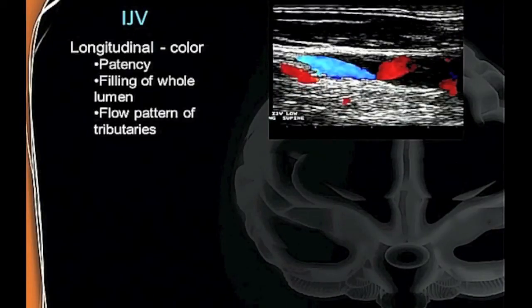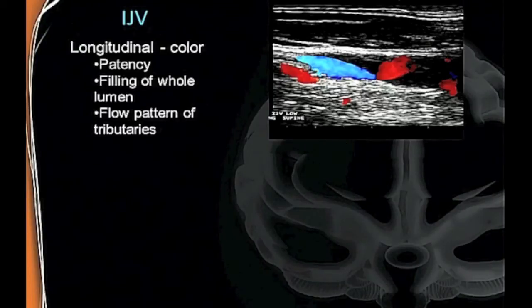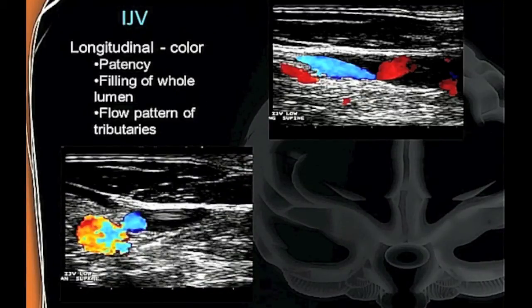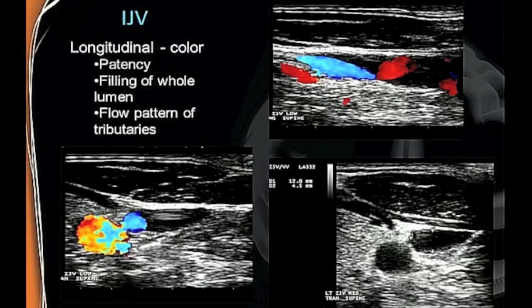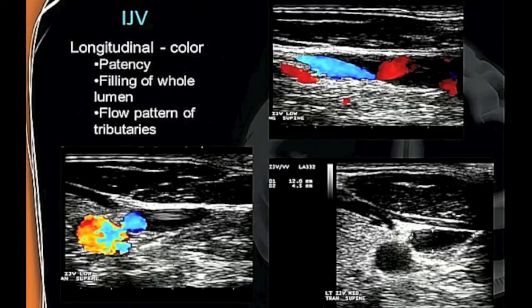Here's why we measure the color flow and not just the lumen. In this example of longitudinal color flow, you can see that something's not filling with color. In transverse, you get the same effect—a black area. If you were to measure just the lumen, you'd measure it much larger, when actually that black area is not flowing. This patient went on to IVUS, and there was a septum there stopping the flow—IVUS showed it at the exact location. So this is why we always measure the flow, never just the lumen.